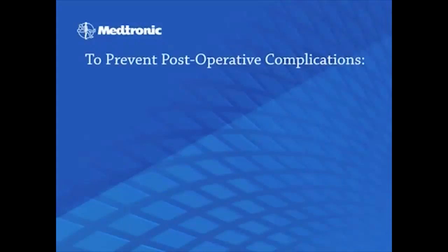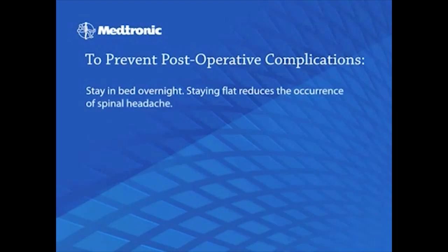To prevent postoperative complications, advise patients to stay in bed overnight. Staying flat reduces the occurrence of spinal headache.